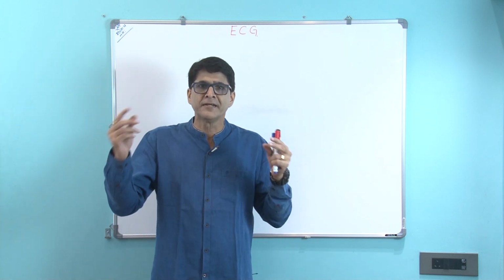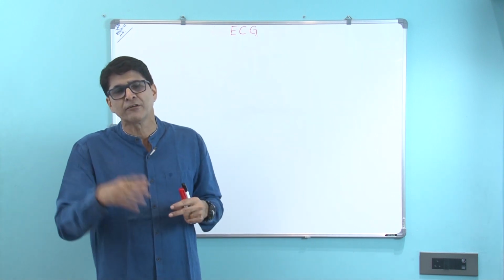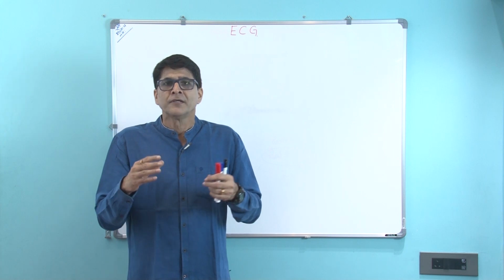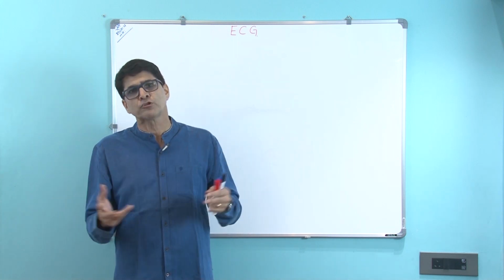So, for example, between lead 1 and lead 2, lead 2 and lead 3, or lead 1 and 3. As I proceed, you will come to know that. ECG is a very highly versatile test, instantly available, and it has no substitute.